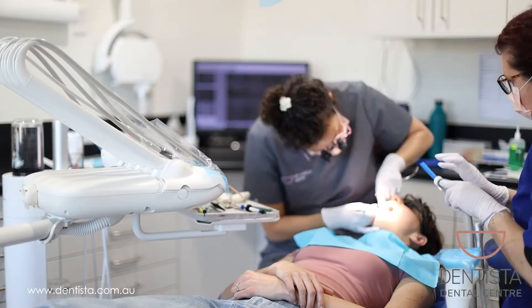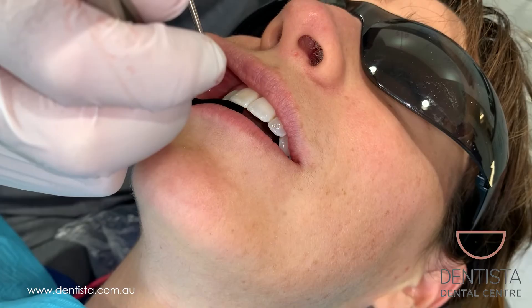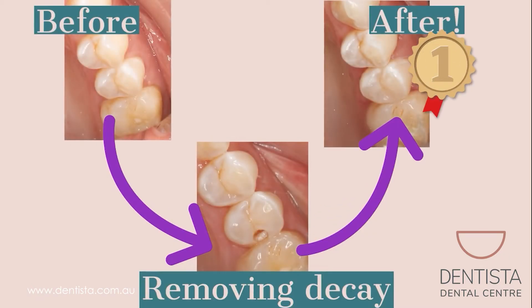Once all the filling material is in we take the matrix off, polish it out, check with the floss and finally check the bite. Erin's filling is all done. Can't even tell — it gets a gold star.